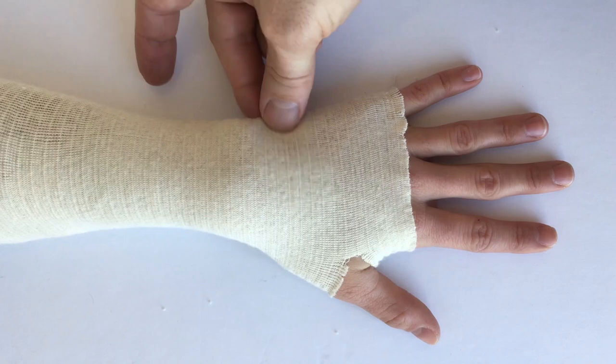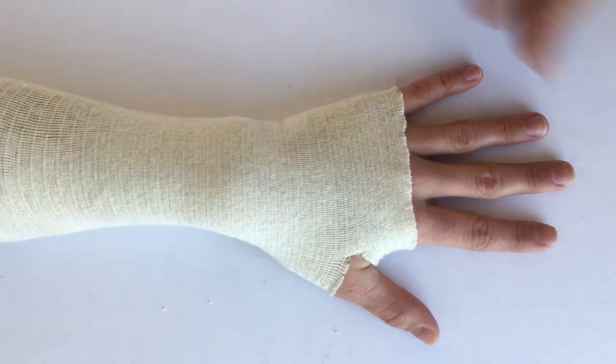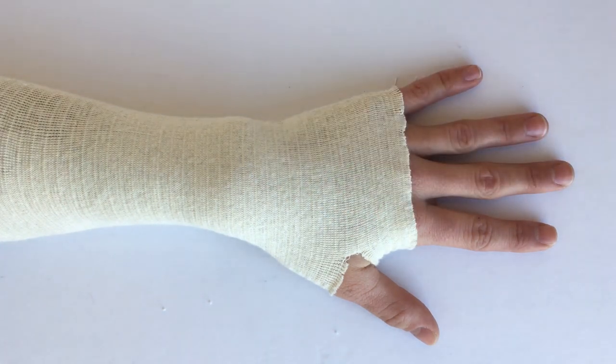You can just kind of tug this away to test that compression — you want it snug, not tight. I also like to cut a little hole for the thumb to anchor it on the hand and prevent it from migrating.